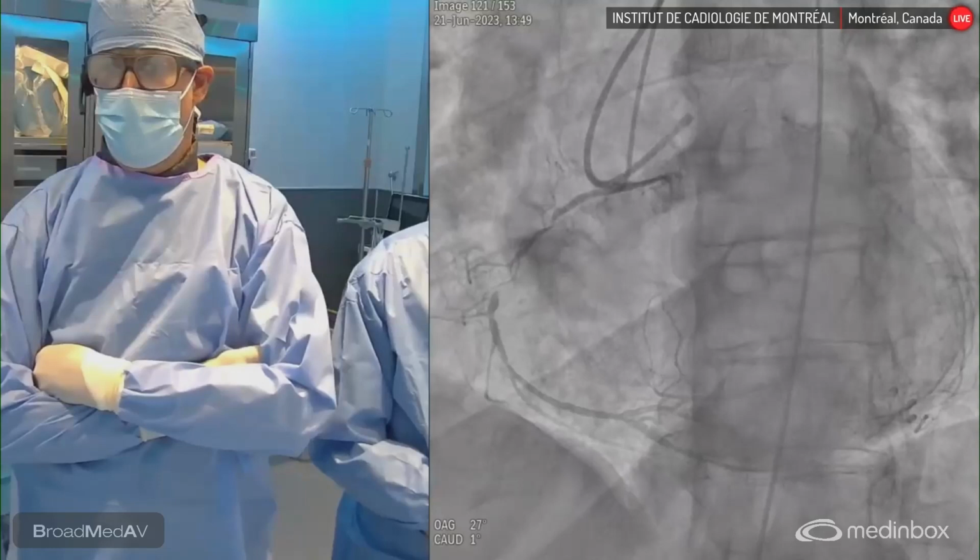And of course, when we look at the right coronary artery, we can actually see there are bridging collaterals that are somewhat of an issue because, of course, the wire will have a tendency to go through them. Second is that we can see nice collaterals coming from the septal perforators of the LAD going to the PDA, filling the right coronary artery retrograde. And we can also see part of the landing zone being vascularized by bridging collaterals. We see a good landing.